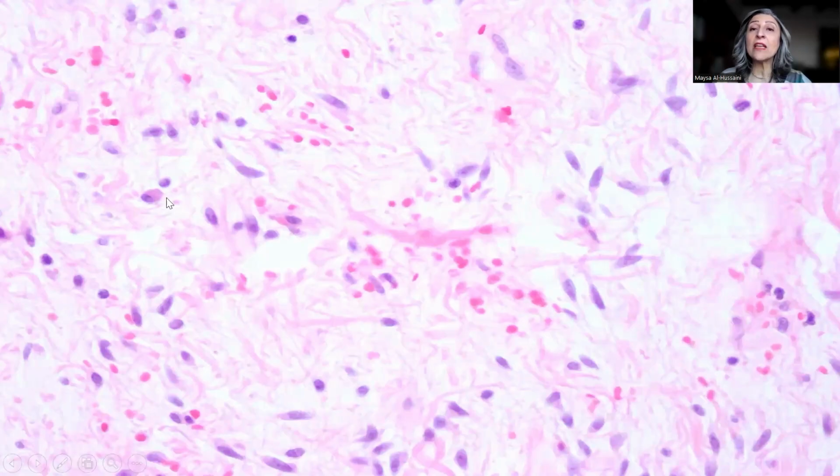In some areas, even this lipomatous appearance is completely absent. What you see is the spindle cells as well as the stellate cells, and then this very characteristic collagen, which is the ropy type of collagen, extremely important to render or support the diagnosis of a spindle cell lipoma. Again, other areas which are fat poor areas, composed mostly of those spindle-shaped cells and the ropy collagen that is present in the background, as well as the mast cells.